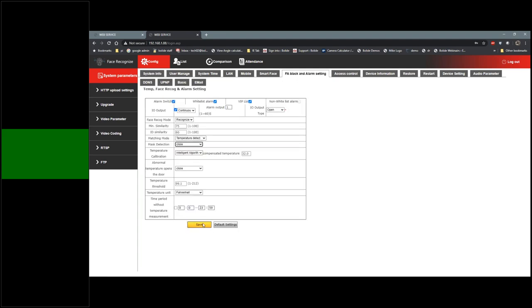Now I'll do it without the mask — temperature normal. So we're using it as a standalone. You can do that without connecting the camera to the network. The times you would need it on a network is if you want to use the CMS. You can have it on a private network. I recommend having it on a network because you can do more things and have more interactivity with it.